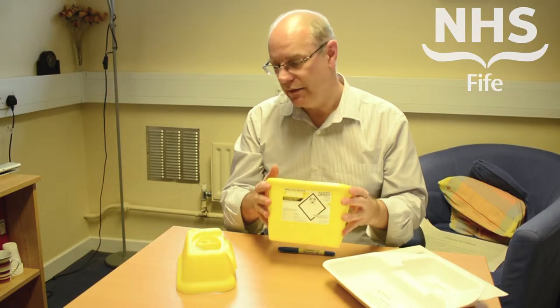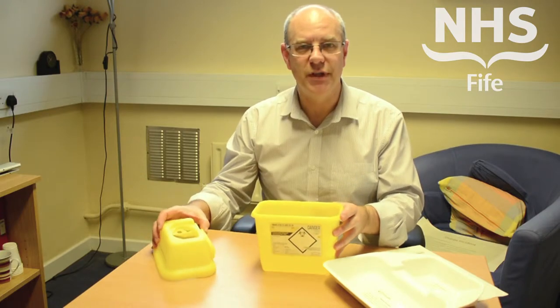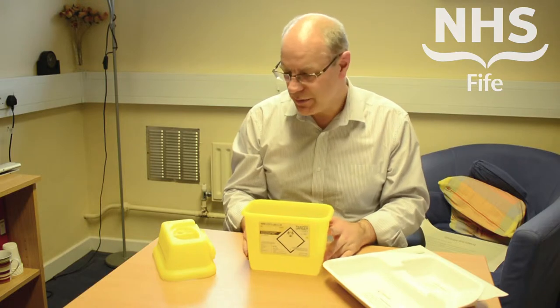This is a typical sharps bin. There are various models available throughout the NHS, but they all work on a very similar principle.